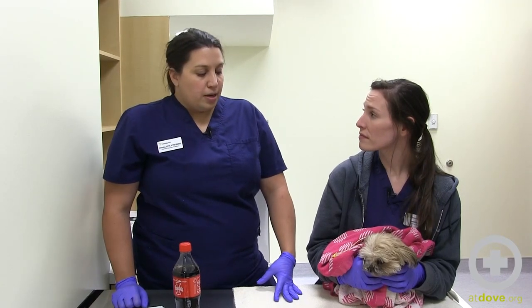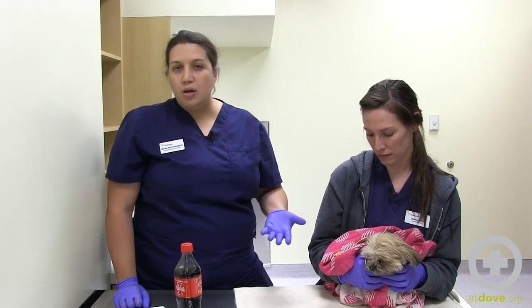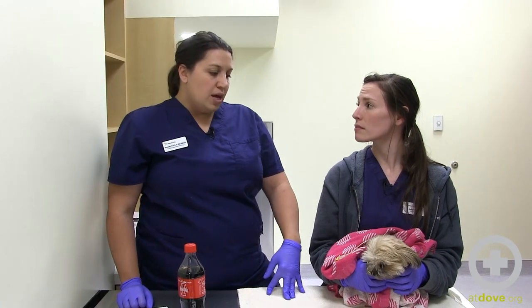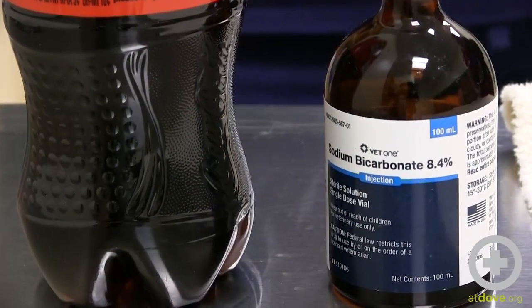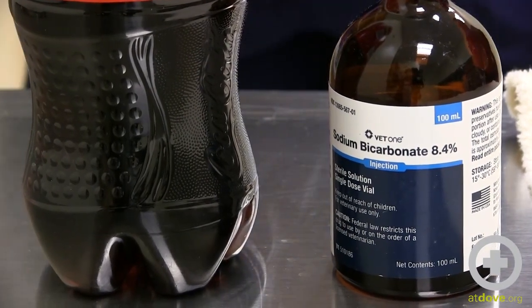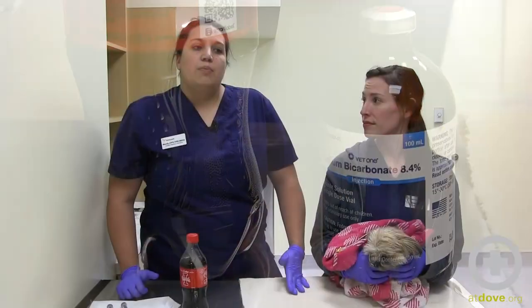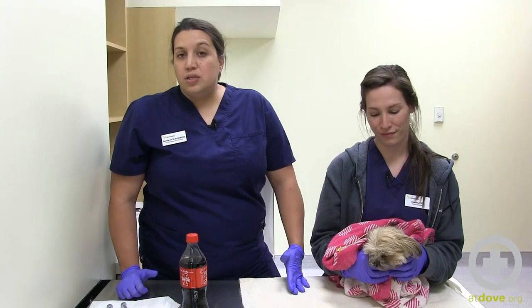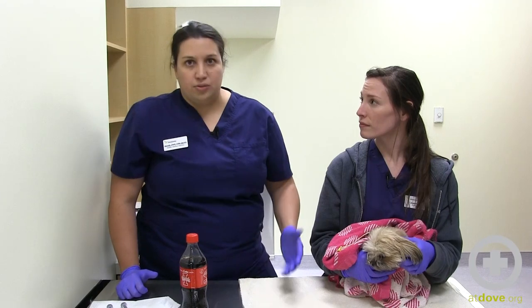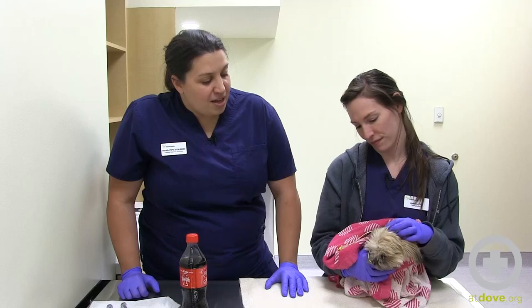Another option that people have used successfully is sodium bicarb — most of us carry this in our crash carts or on the hospital shelf. A little bit of bicarb can be effective for the same kind of thought process as the Coca-Cola. The same considerations apply: be really careful about the amount you're using to unclog the tube, because too much could cause metabolic derangements that we definitely don't want in these critical patients. And that's how we unclog nasogastric tubes.